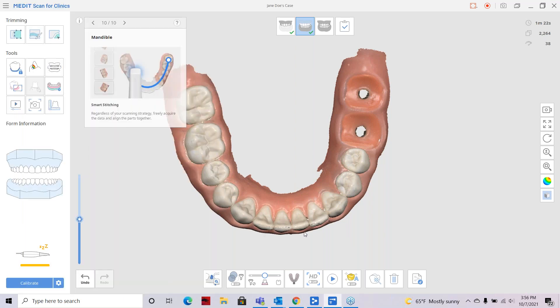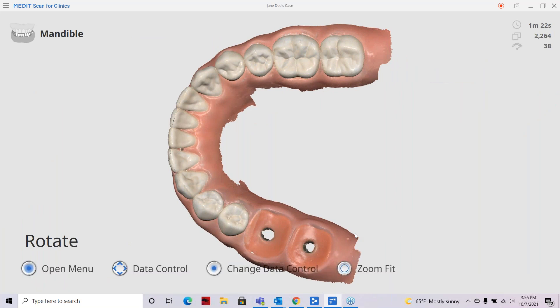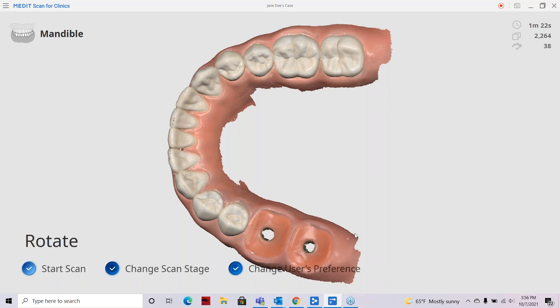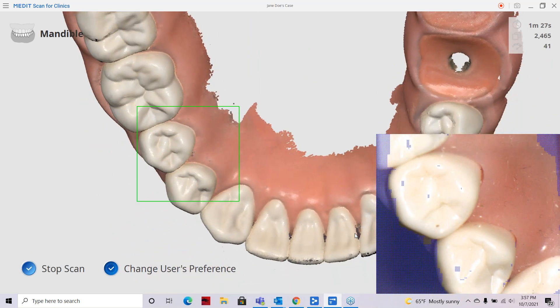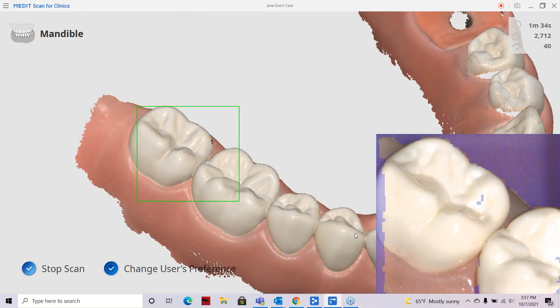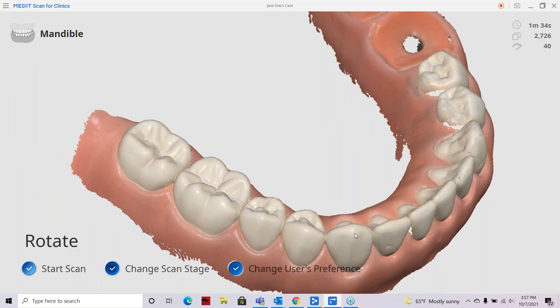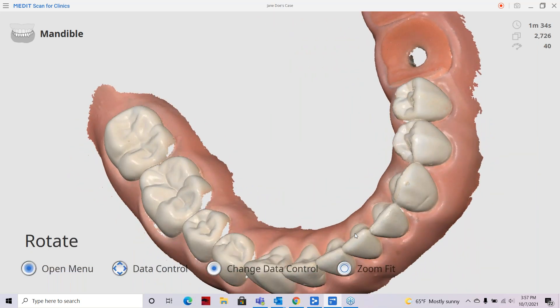After covering scan path and smart stitching, I want to quickly demo what this looks like in remote control mode. Press the white remote button below the blue button on the scanner. It works exactly the same way. In remote control mode, the other icons on the screen are eliminated so you just have the model — it's a little larger to view and allows you to see the model without going back to touch your keyboard.